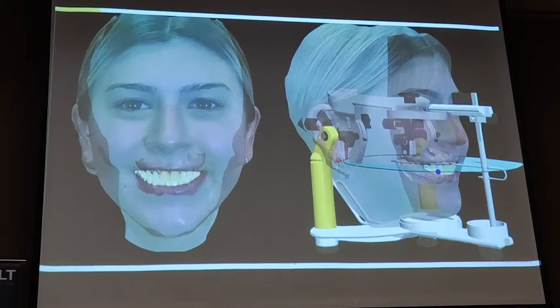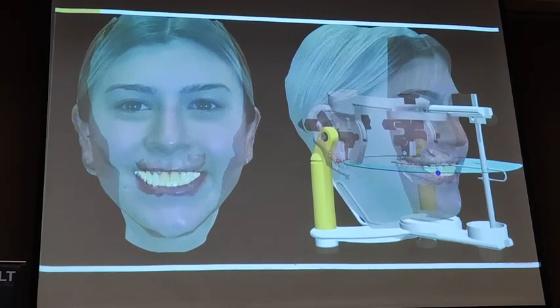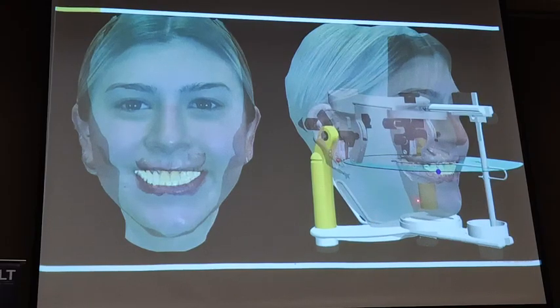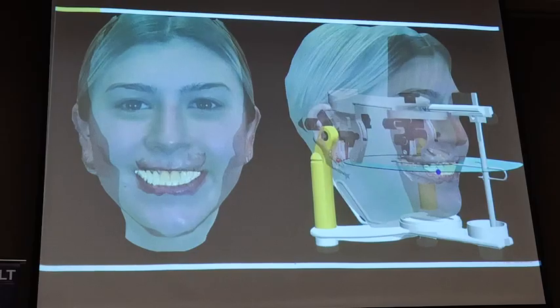So now, in the present era, we are in such a condition where we can merge the STL data, the face scan, STL data, the virtual articulator, CBCT, along with your 2D images. Such a wonderful concept. We merge everything. We literally have the patient in our hand to design whatever processes we want to deliver.